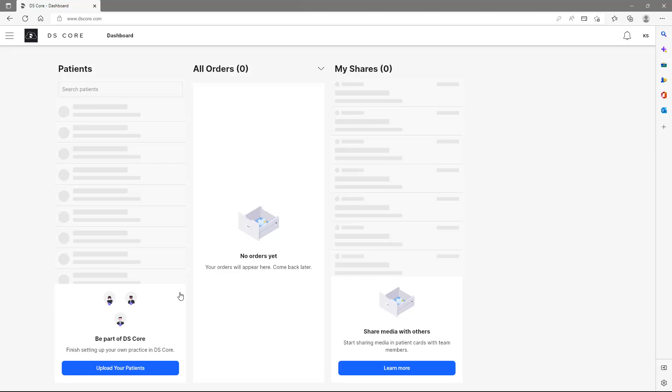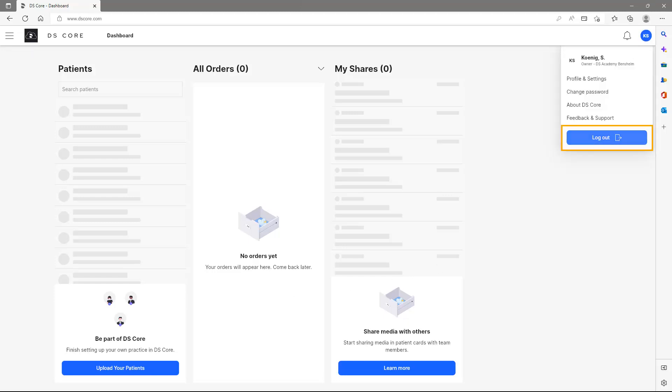To log out of the account, we tap the button at the top right and in addition to the logout function, we also have the opportunity to view or modify our profile and settings, to change the password, to view information about DSCore, as well as to request feedback and support from our DSCore support.